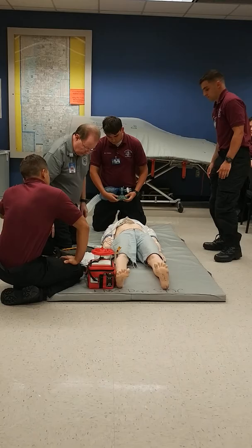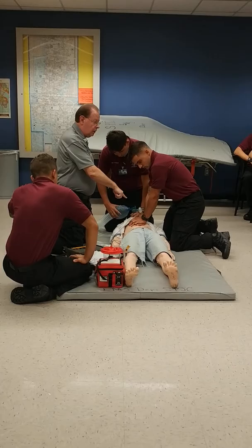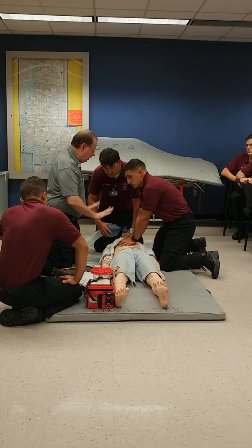No shock advised. What do we do? Immediately begin CPR. If it had been programmed for shock, we would charge the machine, and the compressor would continue compressions while charging.